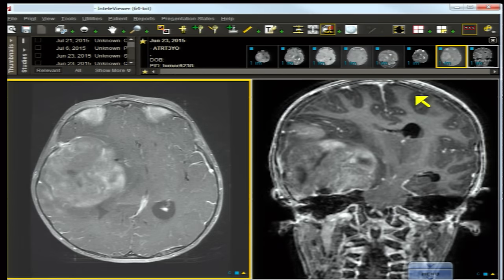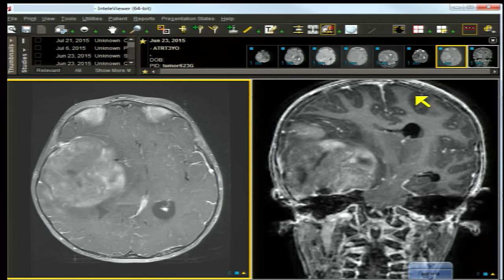The primitive neuroectodermal tumor or medulloblastoma is the major differential diagnosis. If shown a mass resembling a medulloblastoma in someone three years of age or younger, you should strongly think ATRT, though it may not always be given as a choice in a testing setting. Medulloblastomas occur in slightly older children and are less likely to have cystic foci.